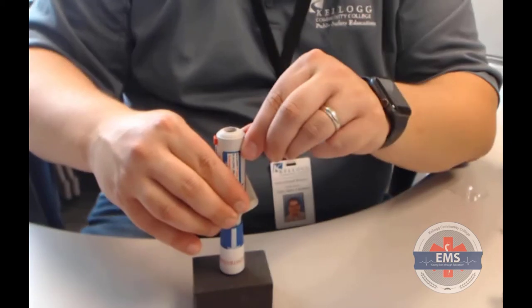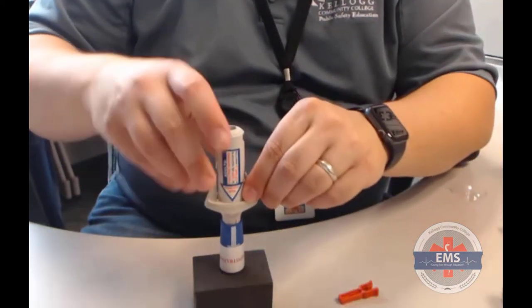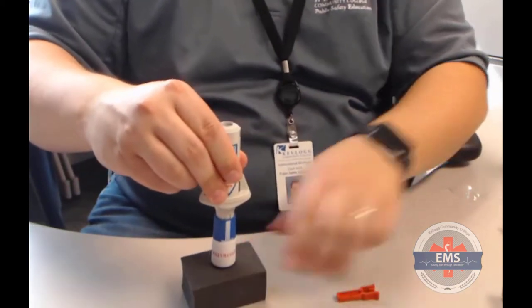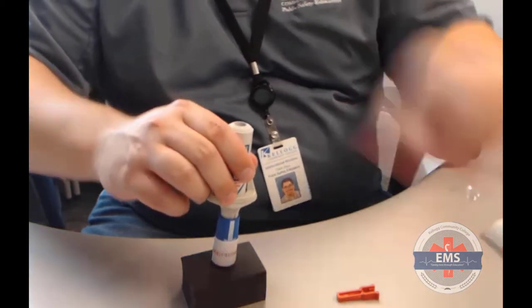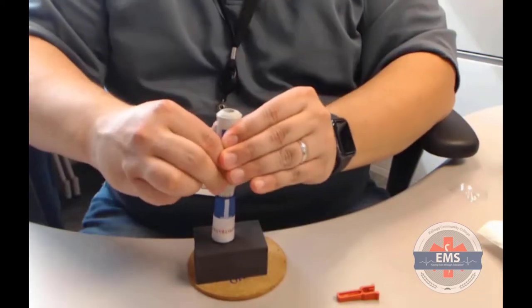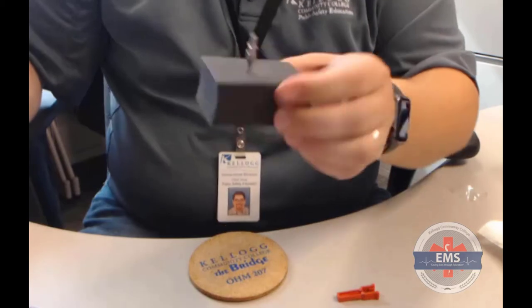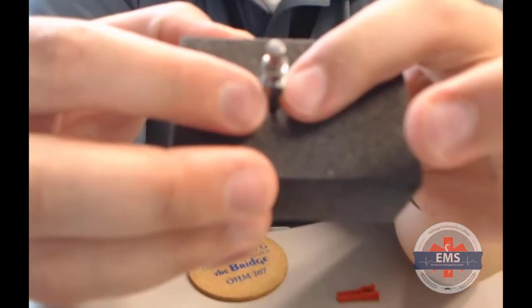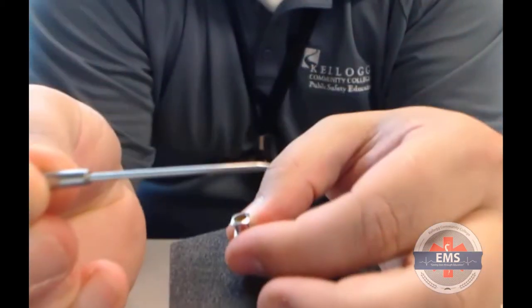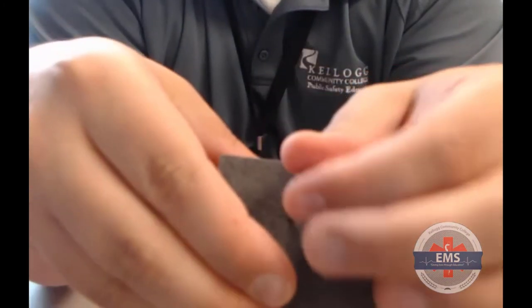In this case, what I can do is remove the safety. Okay, take my hands, secure them in place, and then just press this bad boy down. Let's see if it works. I'm going to put something underneath it so it doesn't go through my desk, just in case. And then you would press it into the right location, and at that point in time you can release it. Now what you'll see here is you've got, again, your needle, but there's still a stylet inside that needle. That's that guy there that sticks in there. You can see that. We'll go directly back into here.